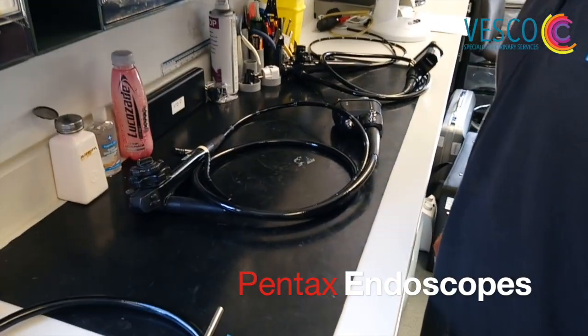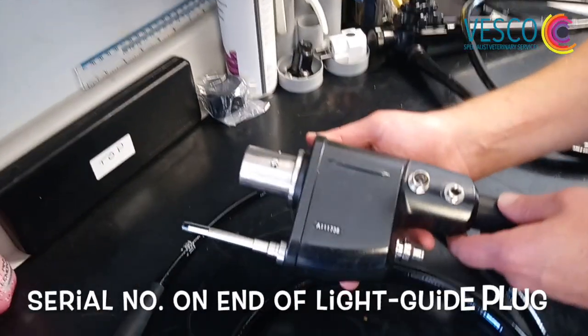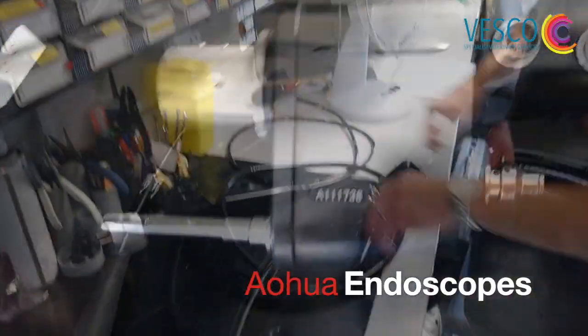Pentax scopes are very similar, so you will find the model number in the same place, next to the biopsy port. The serial number is on the end of the light guide plug, similar to the Olympus.